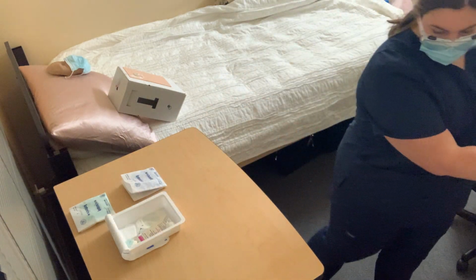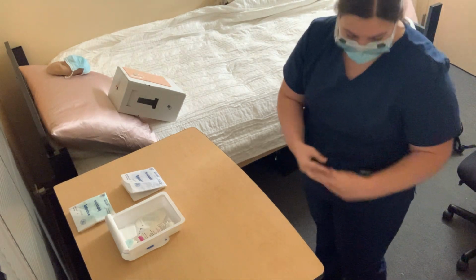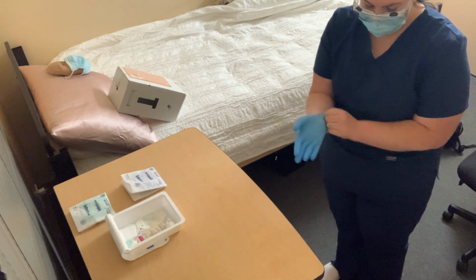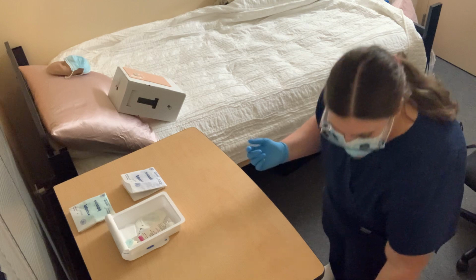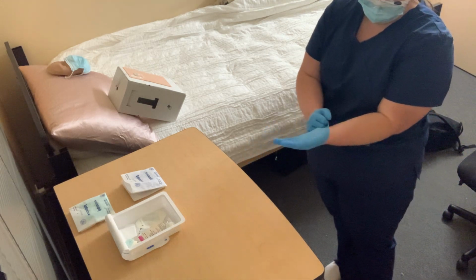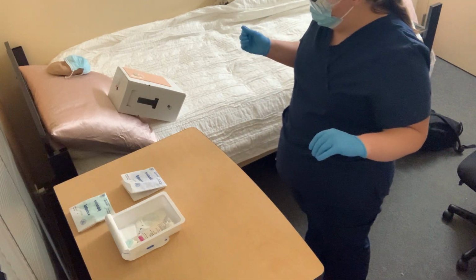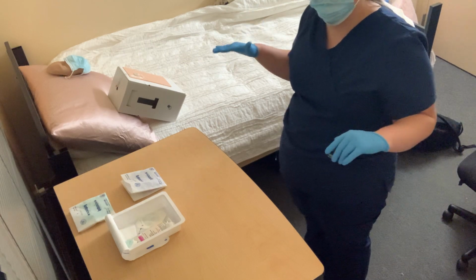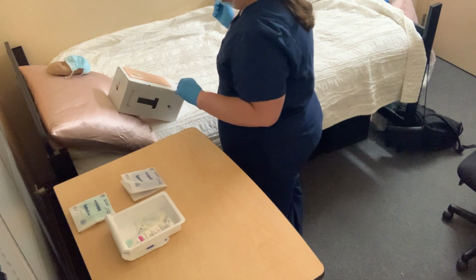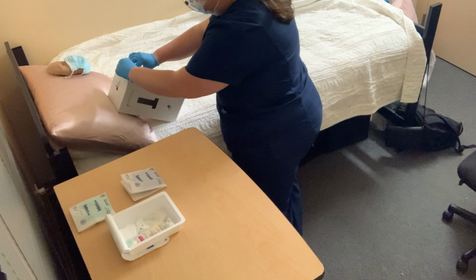I'm going to do hand hygiene again and put on another pair of gloves. And I'm going to go ahead and remove the dressing on the patient. Before I do so, I'm going to make sure that the tubing is clamped to avoid an air embolism. All right, Mr. Smith, I'm going to start removing the dressing now. Please let me know if you have any discomfort while I'm removing it.